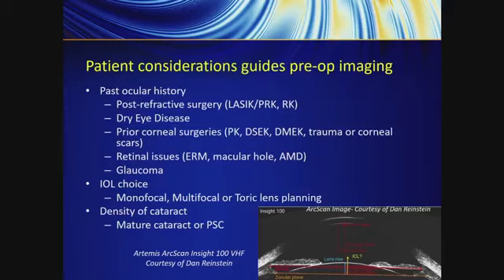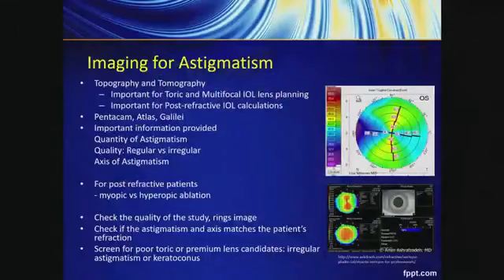And I think that using high-resolution digital ultrasound to look at the lens, for example, in a posterior polar cataract, you can image the back of the lens, which is very helpful. You can also do proper sizing of the sulcus, the iris, the anterior chamber, the bag. And again, those are things that will help us hopefully pick the right power. If in the future we have IOLs of different sizes, we can actually select which one is right for that eye.